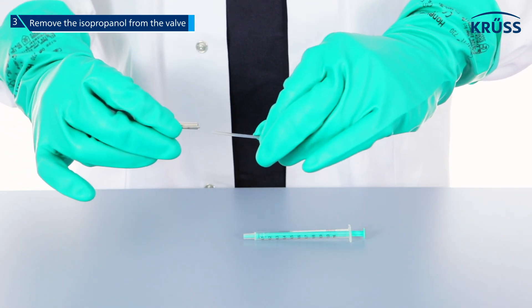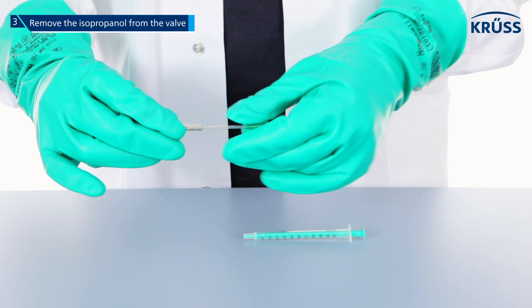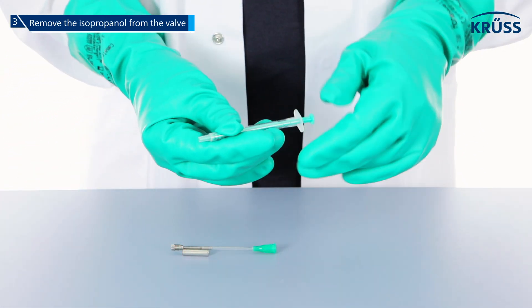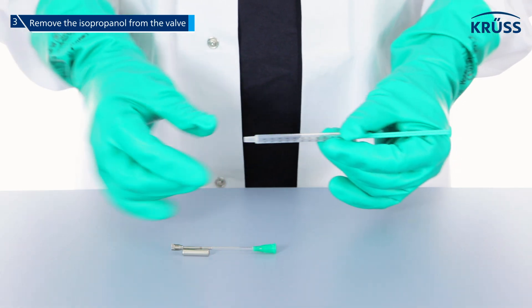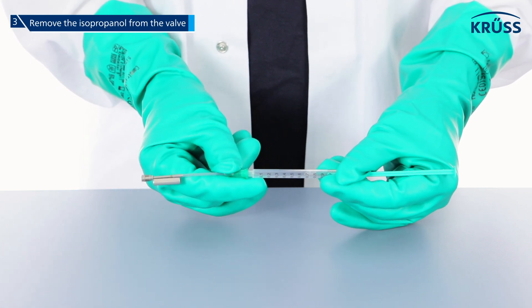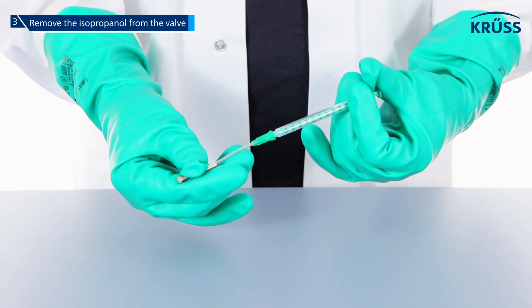Step 3: remove the isopropanol from the valve. Use a clean dry syringe and a clean dry plastic needle. Push the thin side of the valve hand tight into the plastic needle. Pull air into the syringe and push the open end of the plastic needle onto the syringe. Use the syringe to push air through the needle and valve 10 times.